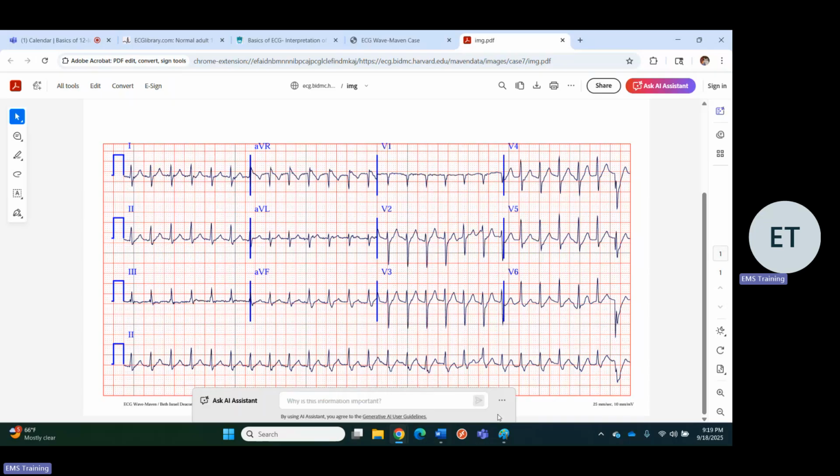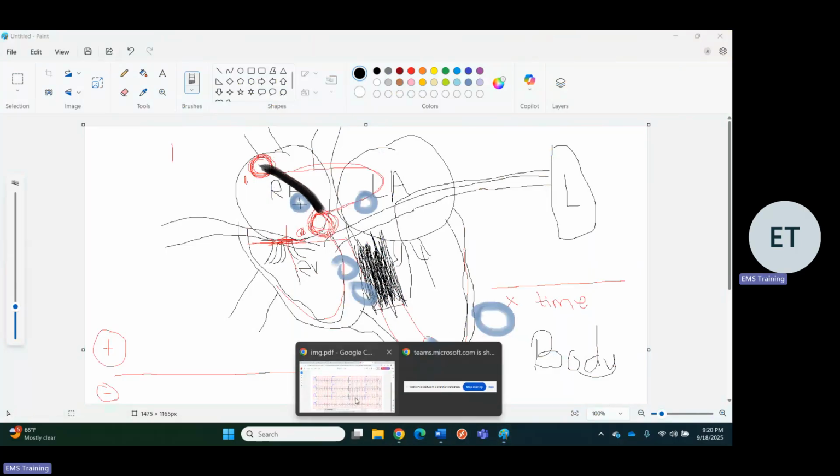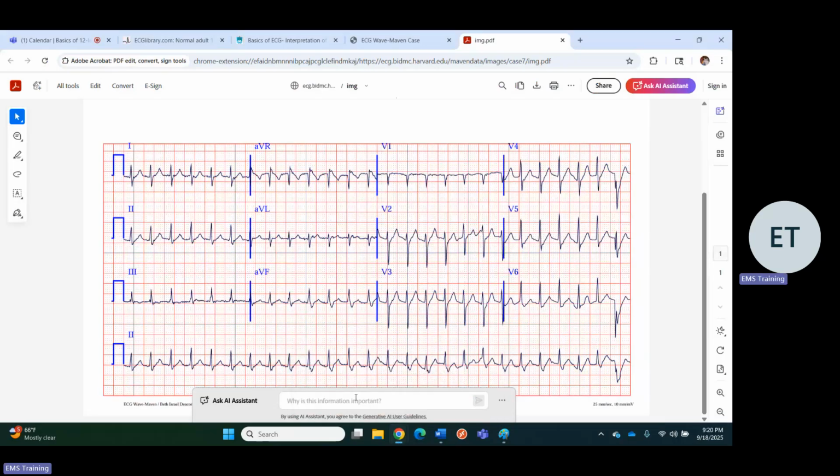Because normally these tachycardias don't exist here. Sinus tach at a perfect rate in an elderly person, although I didn't read what the patient's age was, but assuming they're old, sinus tach doesn't really go above 150 to 160. When it does, it's usually in a younger patient.